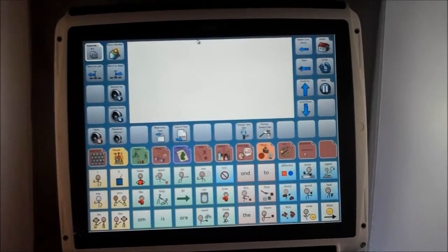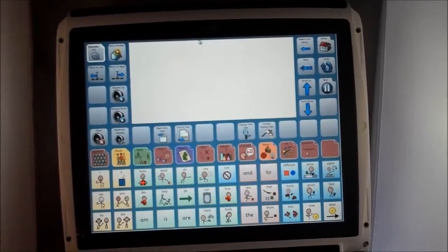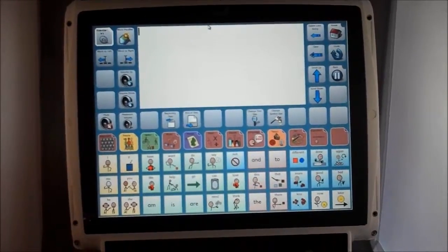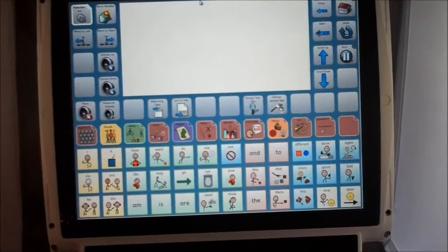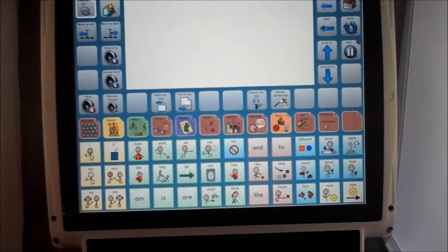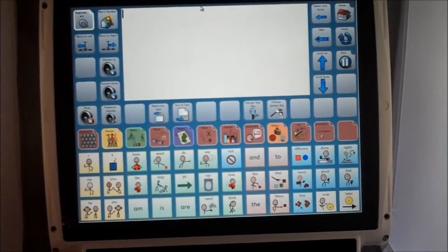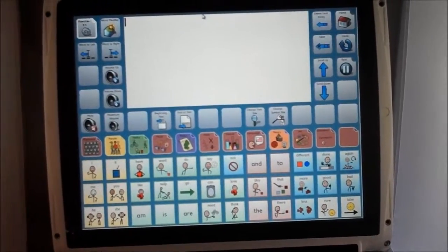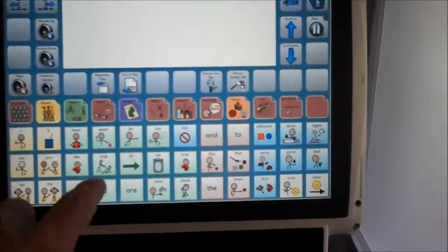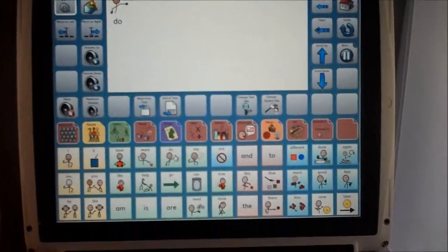So just a brief intro into the Tobii. The C12, which is this upper piece up here, is for all intents and purposes a Windows laptop, a touchscreen capable Windows laptop, and so as a care provider, we can interact with the Tobii by touching the screen. So I can see Do showed up there.